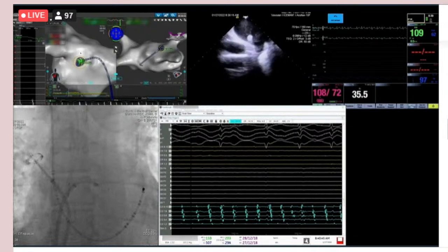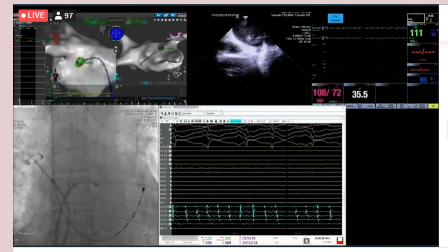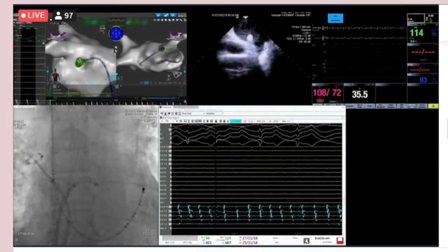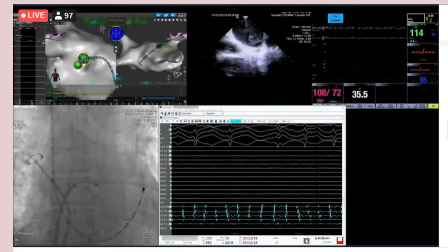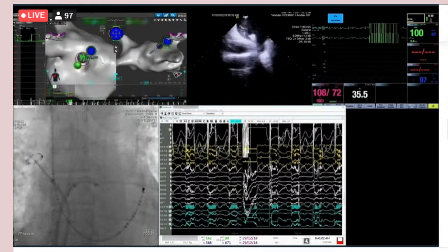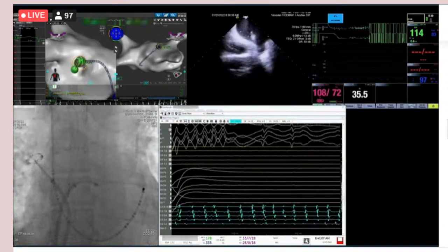This is a little different. I think you saw Andrea do a case this morning. The time at a single location for the other technology is around 10 seconds because it delivers 3 different ones in that 10 seconds. This is very rapid in that literally it's one spot, it's a couple of seconds, and then you move it.